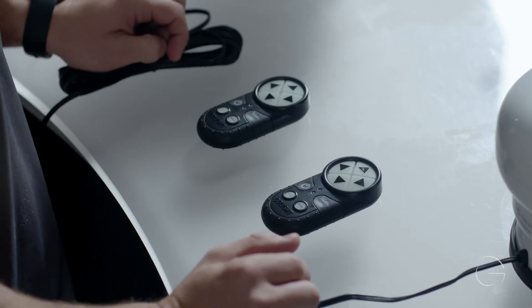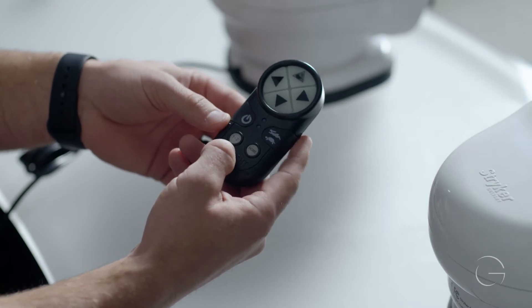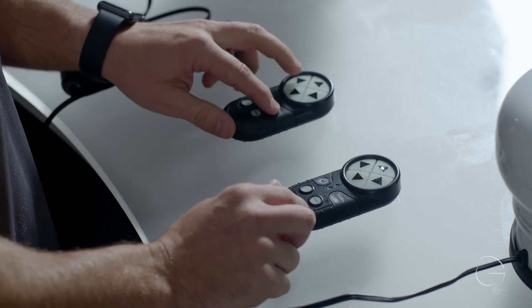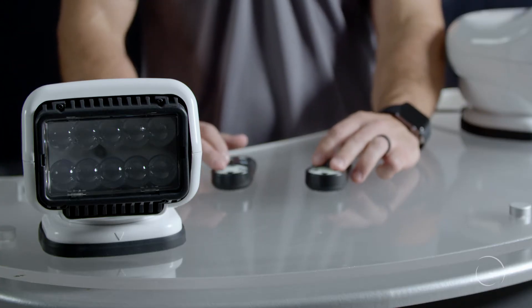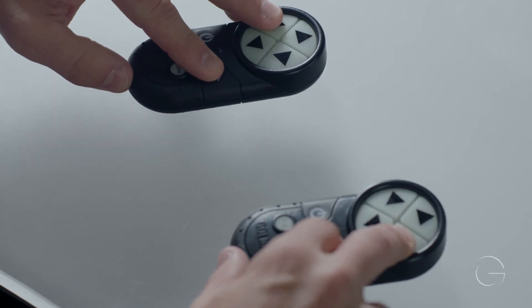To do so, you will take your original remote and press the speed and the left button, and then on the secondary remote, you will press the speed and the right button.